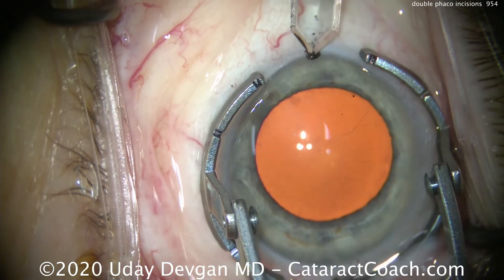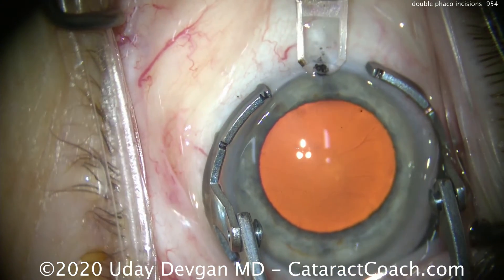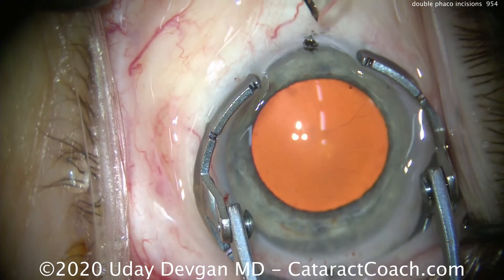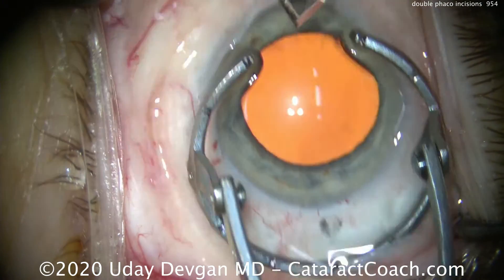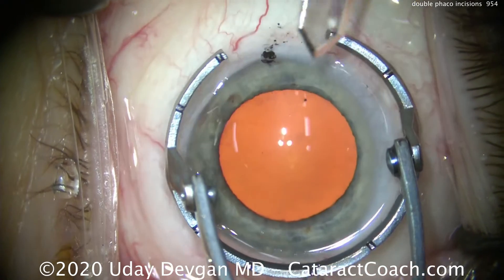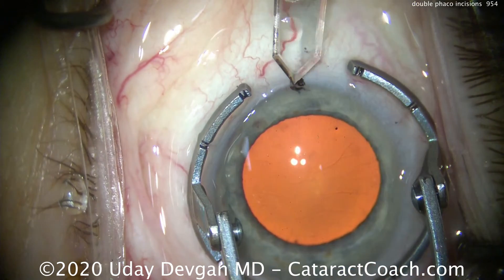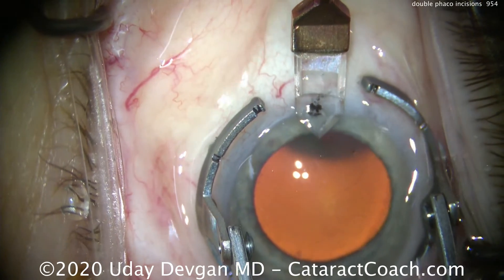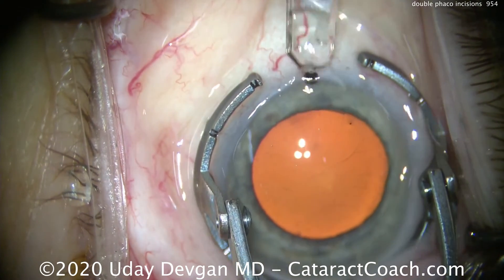Now on the opposite side it's a little tougher — you still hold the same instruments in the same hand, so the keratome is in the right hand. For better access, have the patient look all the way to the side; that gives a much better approach because the patient's nose is in the way otherwise. We want an almost identical incision on the opposite side of the cornea.